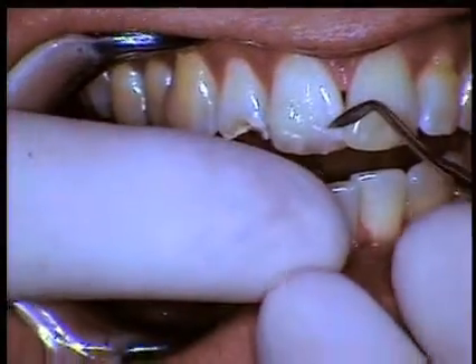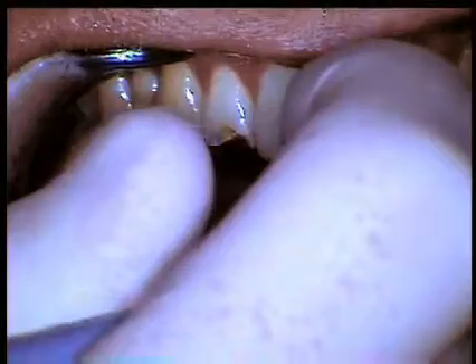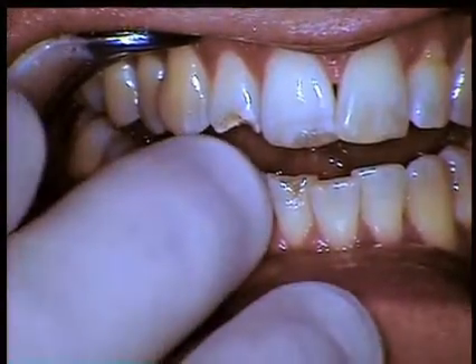Now the next step is to get this material off, lean the patient back, give anesthesia, and get started with the process. There are two ways to look at doing this.